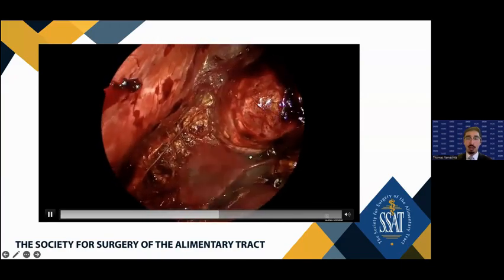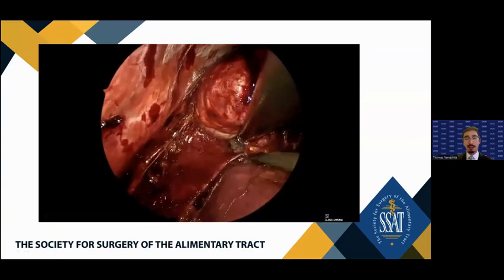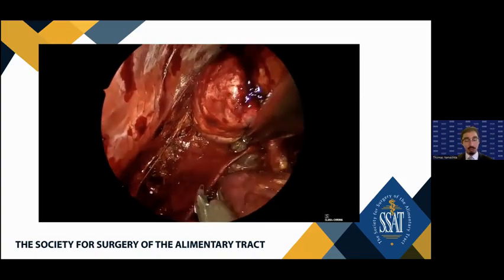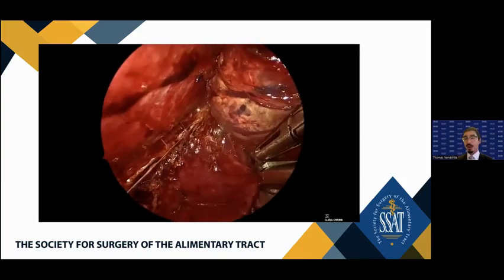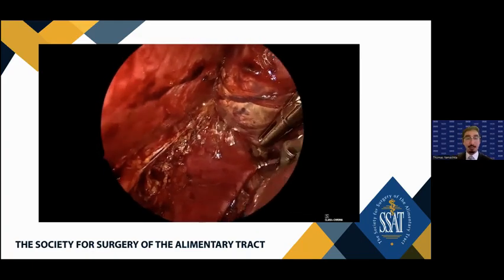And what you saw there was me struggling just with the ports a little bit, and there's a little bit of sword fighting. I wanted to keep that in because that's one of the difficulties in this procedure. It's a very tight space. The ports are placed usually in line, and there's some difficulty with relative sword fighting and the angle. So whoever is running the camera also has to have some experience and be a pretty good camera driver.